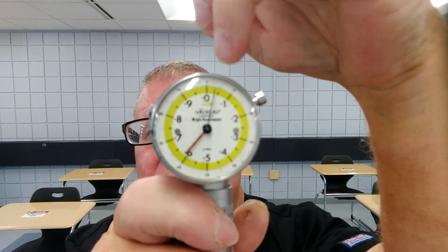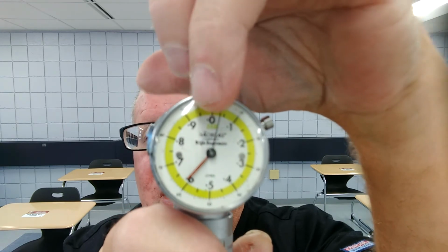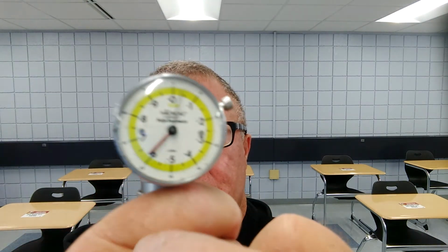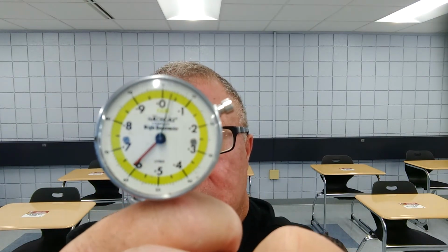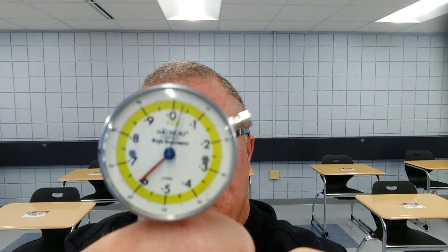Again, I'm going to look at my numbers. It's hard to read, I know, but I'm going to look at the little number, arrow or needle is at 3. And my other needle is at 0.62. Okay, so my vital capacity is 3.62 liters. Or they may say 3,620 milliliters.